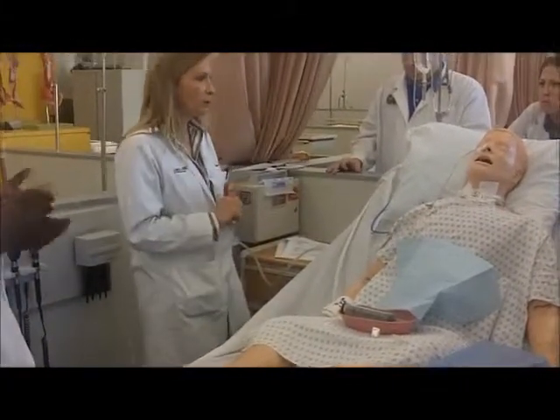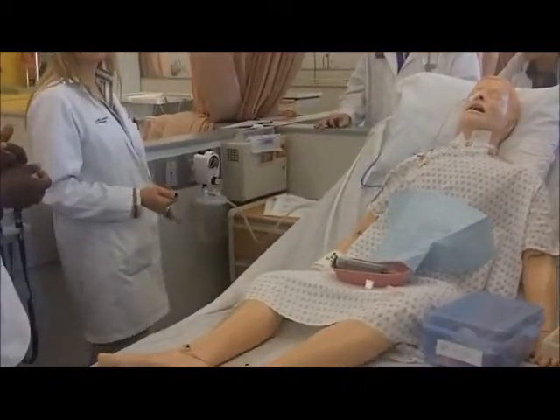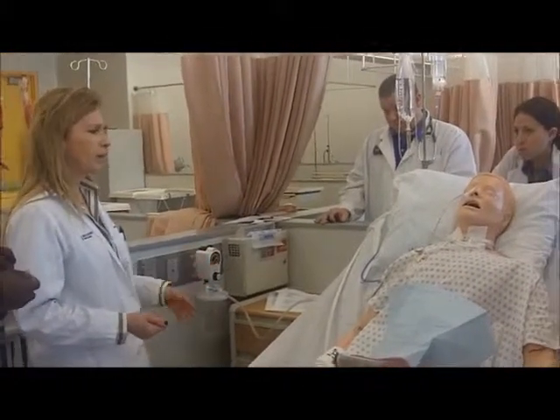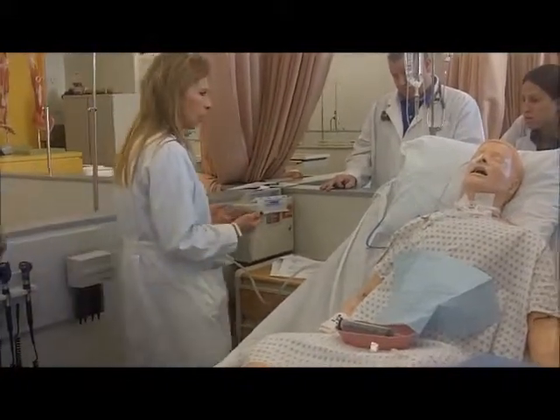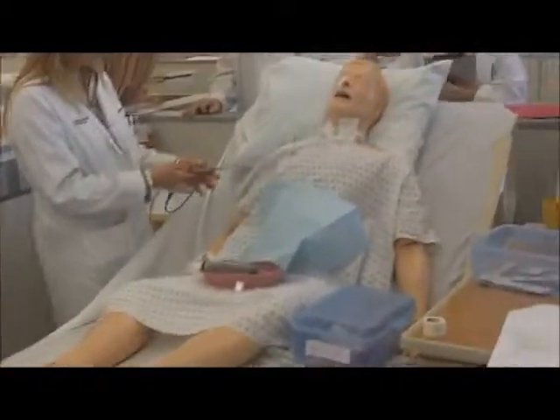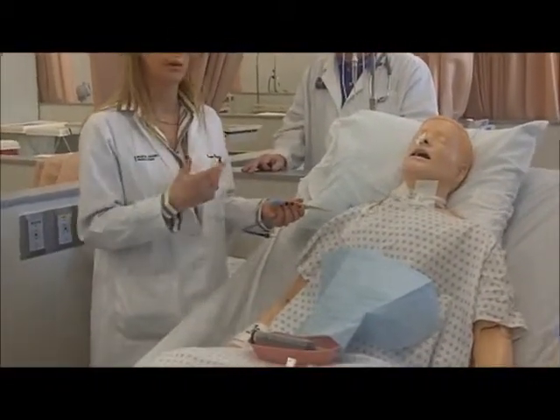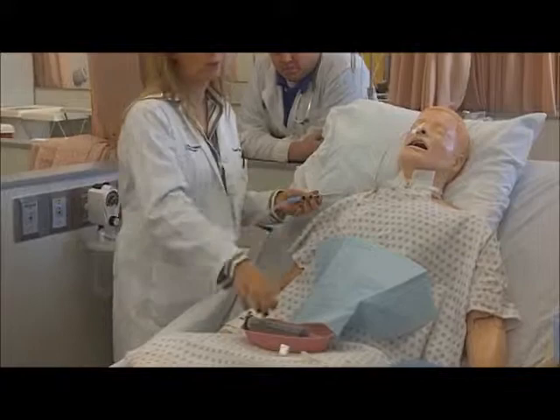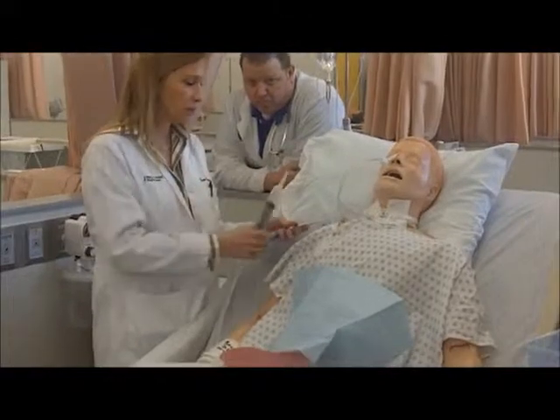Now, sometimes you evaluate your patient and several hours later you look, gosh, there's nothing coming out of there. He has a small bowel obstruction, I should have more gastric secretions. Patient may complain of an upset stomach, some fullness, some nausea. You want to check your placement of your tube. First thing I do, I check my placement. A lot of times there is an obstruction, or their gastric juices are very thick and stuck inside the gut. So I always go through my process, always have a piston syringe in your room, and normal saline to flush.